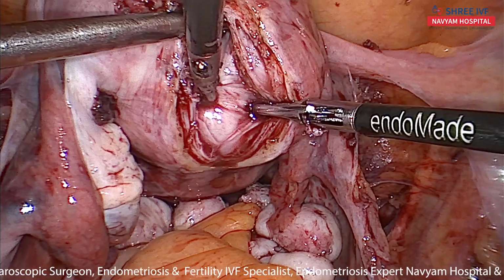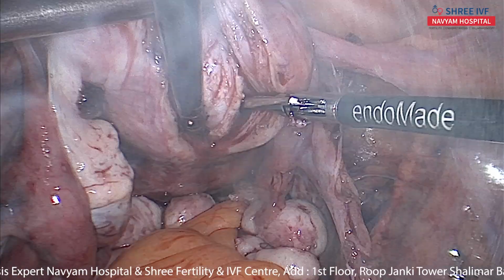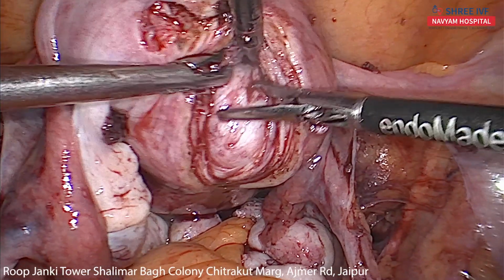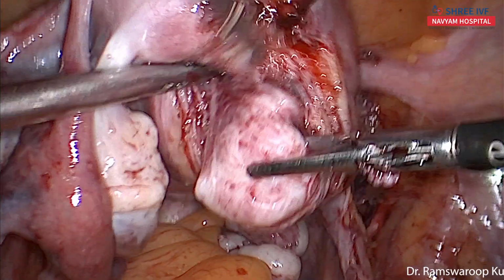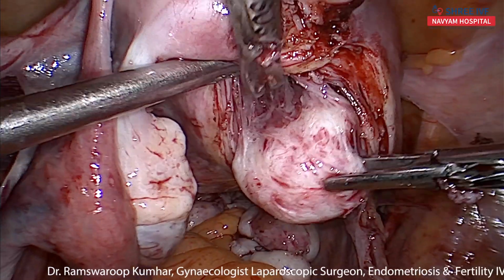One more layer deeper the myoma is, and the myoma is slightly degenerated, this one, and it will come out by the same principle of traction and counter traction.